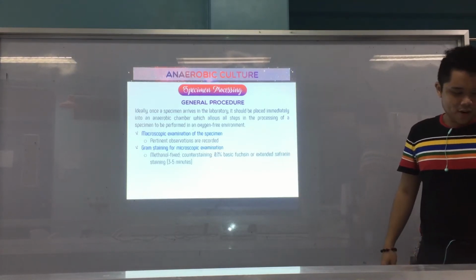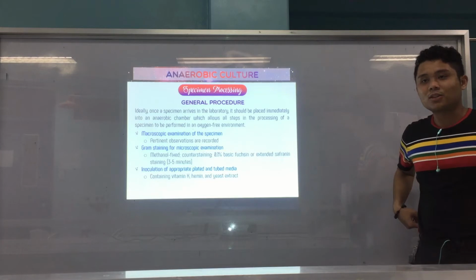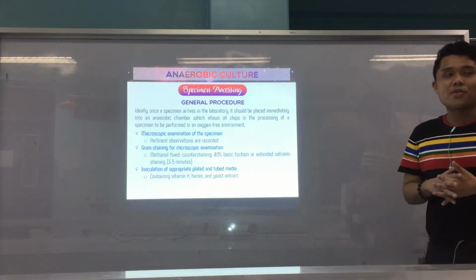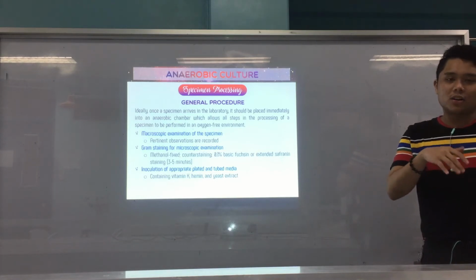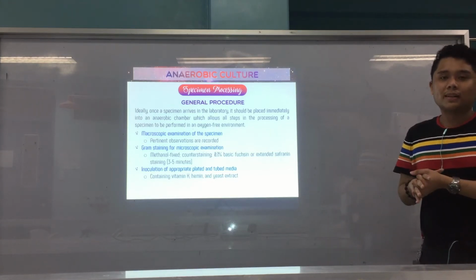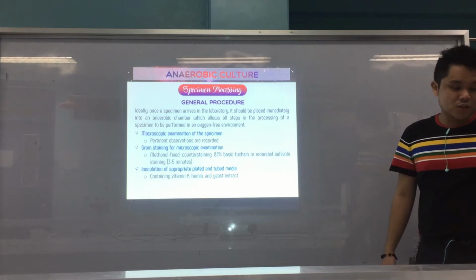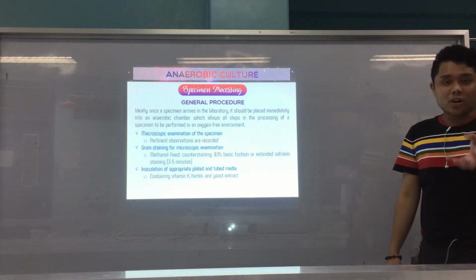Alright, methanol fixed. Next, inoculation of appropriate plated and tube media. As I mentioned in the culture media prep lecture, anaerobic organisms have their own set of culture media. Although some of them are the same as normal routine culture media, others are specific for them, used only for anaerobic culture. We'll go into that in the next slides. So your culture media may contain vitamin K, hemin, and yeast extract, depending on the needs of the organisms, and some of these are what anaerobes need.